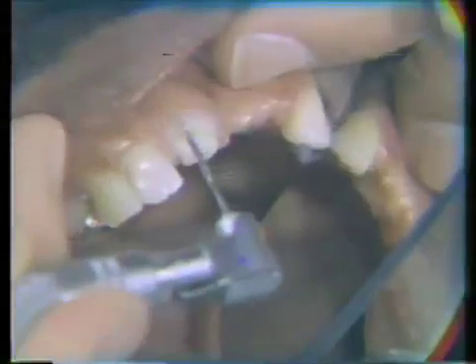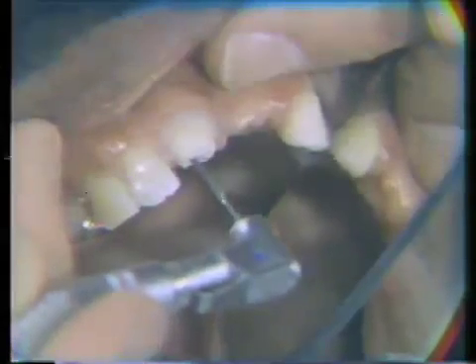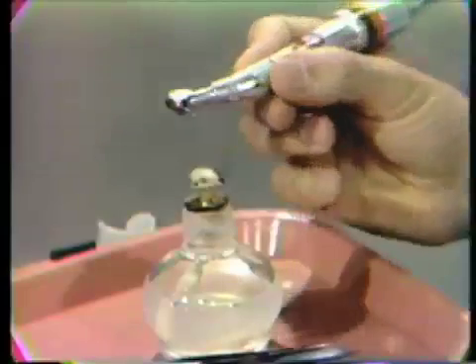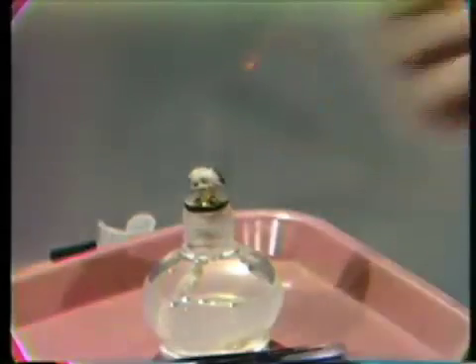Now we're going to use a piso reamer, and the piso reamer comes in different sizes. We've chosen this size because it fits down the canal very nicely. The piso reamer also cuts more efficiently when you warm it, so we will warm this in a little alcohol flame and this will cut the gutta percha much more efficiently. We heat this over the flame and then come back to the opening and start to remove the gutta percha.